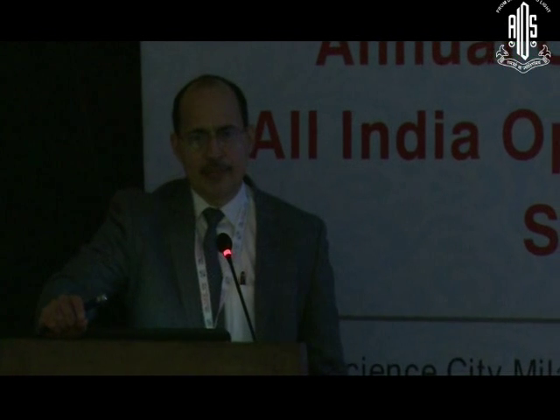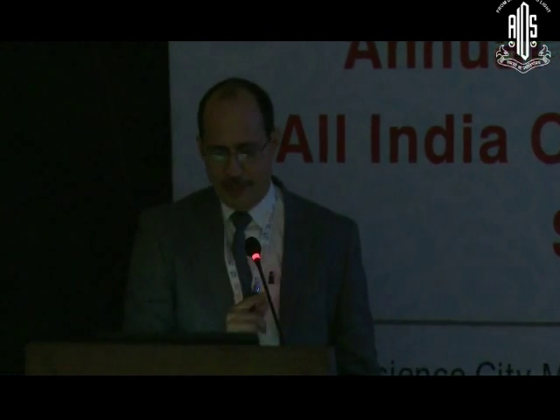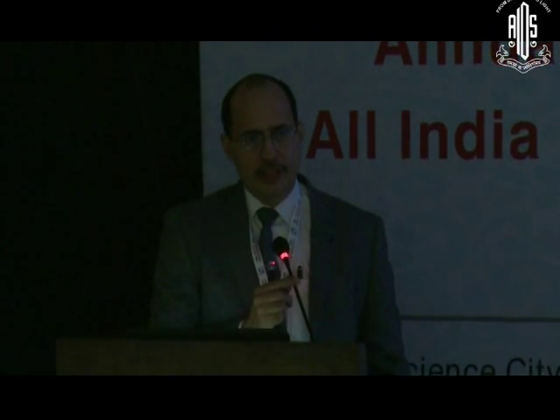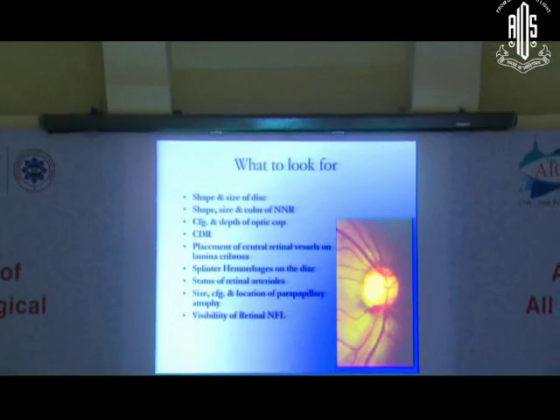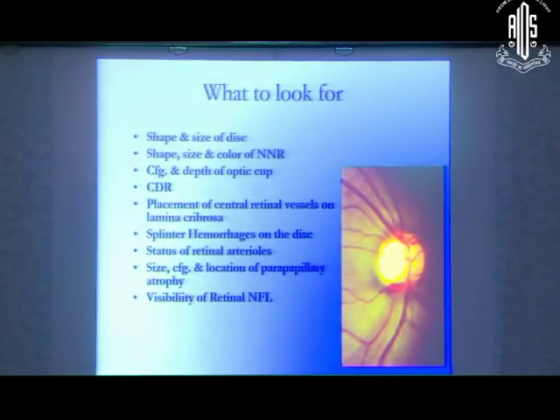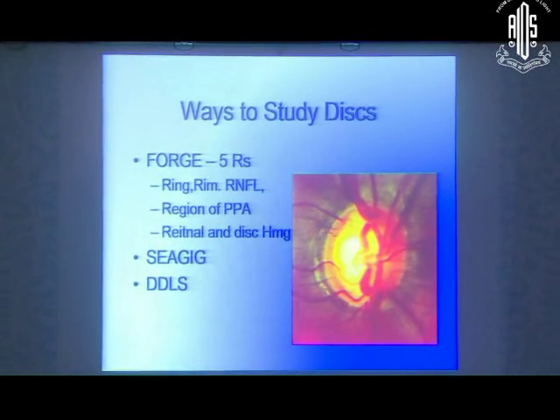The thing is that when you are examining the optic disc, what do you look for? There are a number of signs actually that have been described if you look at the textbooks, and there are so many. And more importantly, even the normal discs vary so much from person to person that it's actually very hard to put all this information logically into a case and then come to a conclusion. So thereby a systematic examination is actually required.